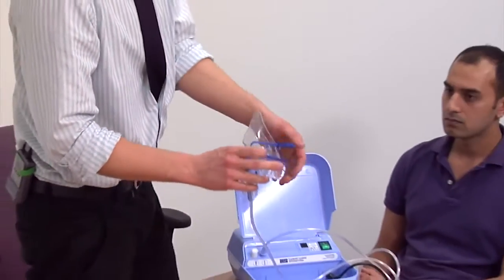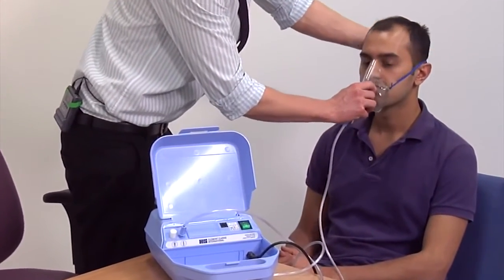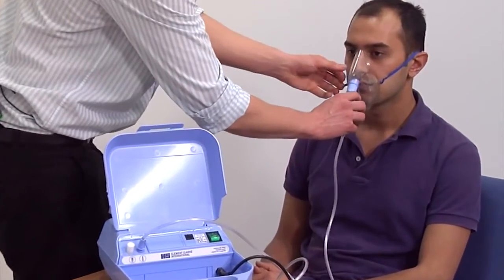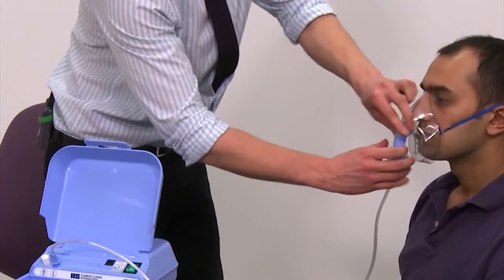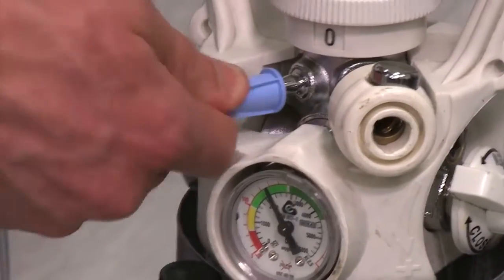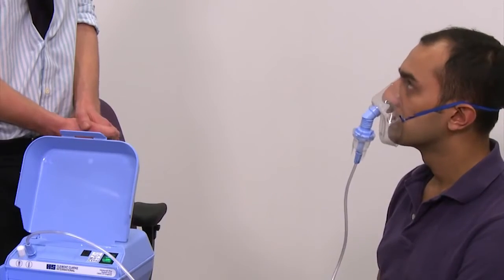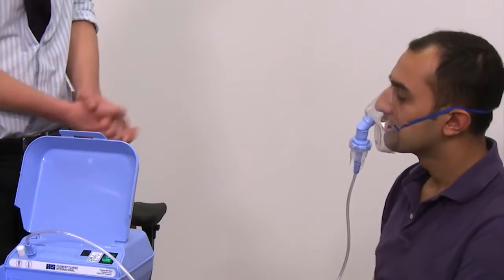A good fit is essential to ensure that vapour does not irritate the patient's eyes. If the patient requires oxygen therapy, the nebuliser chamber and mask can be directly connected to the oxygen outlet for simultaneous delivery of oxygen and nebulized medication. The oxygen flow rate should be between 6 and 8 litres a minute.